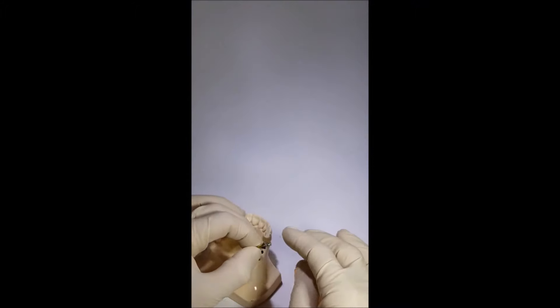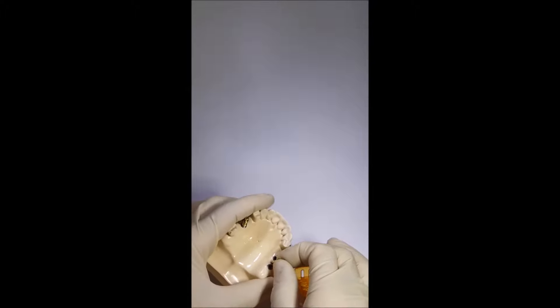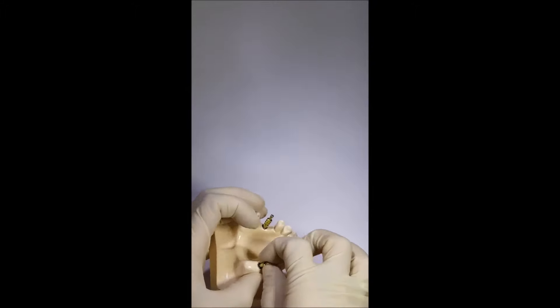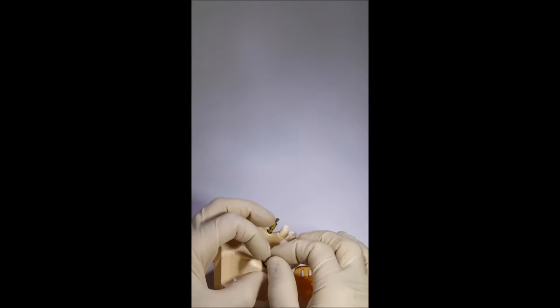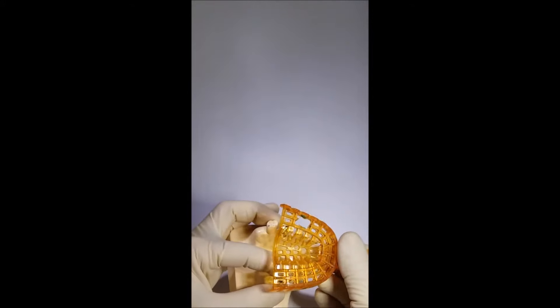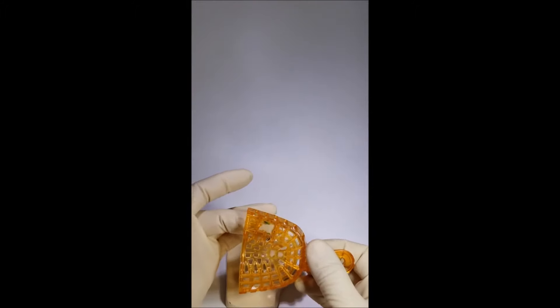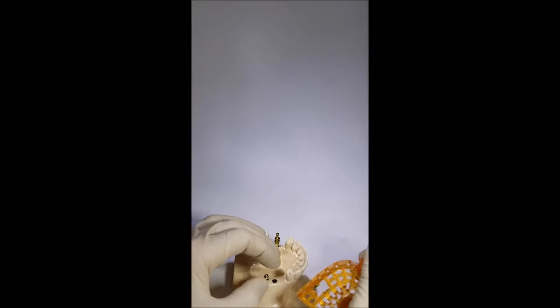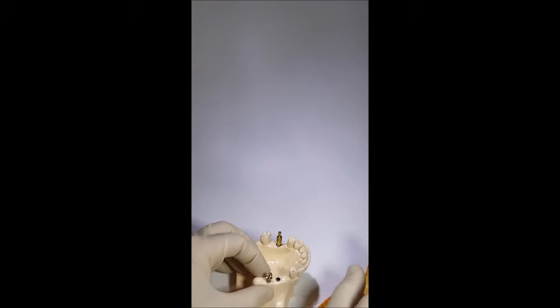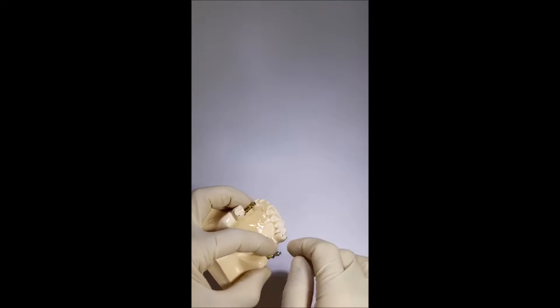There is also a disadvantage: when installing the transfer back into the impression paste, it may not match its place completely. This usually happens due to hard or unset paste, or if impression paste has leaked into the hole under the screw, making it impossible for the transfer to seat correctly. It is better to cover this area with wax once the transfer is fixed in the implant.